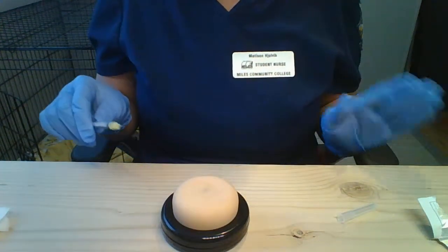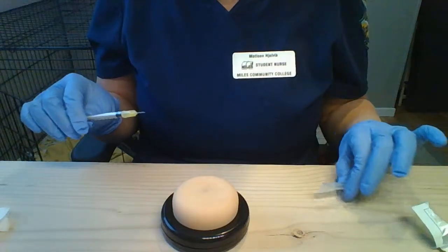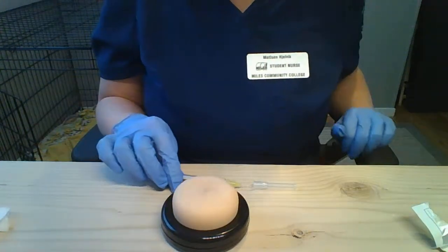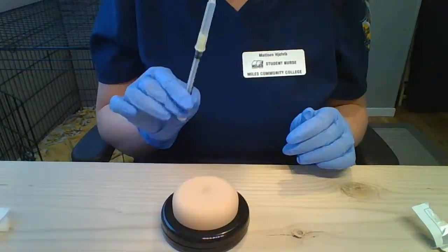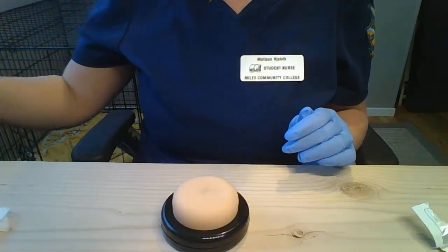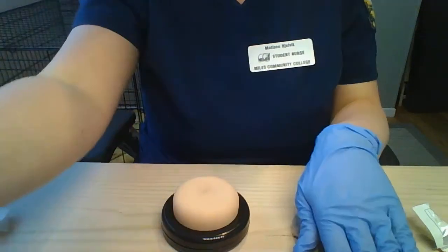And then I would, without recapping, go and dispose of my needle, but I don't have a sharps container near me, so I'm going to recap with the scooping method, one hand. I would carefully dispose of my needle. Then I could dab at the patient's skin if there was any bleeding without wiping it or putting a band-aid on it.